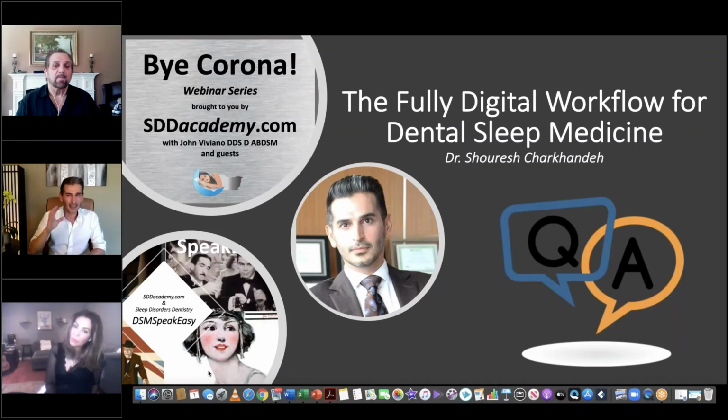Right now, let's focus on how many people we get today, 5 to 10%. If I got 50% of them, I may not have to worry about the vertical patients. Of course, people like John and some of us that are more advanced, whose practice is limited to sleep, and I know hers is as well, may have people for whom an oral appliance is their last chance. In that case, go ahead and play around with whatever you can. But as a general dentist, I like to focus on the easy, simple cases, where I can make them an appliance and it's going to go predictably.